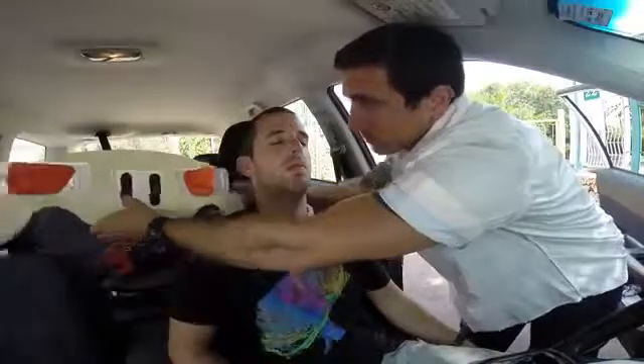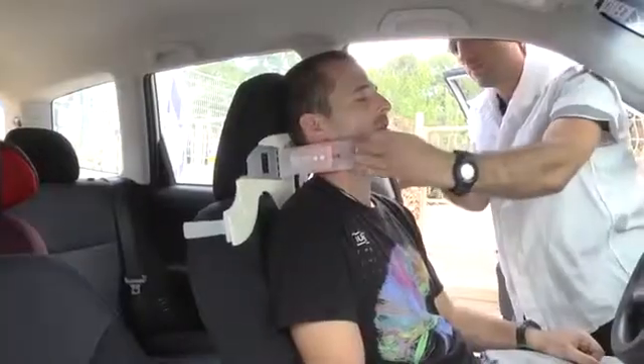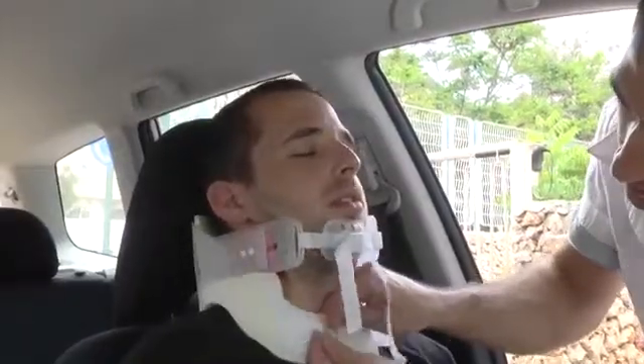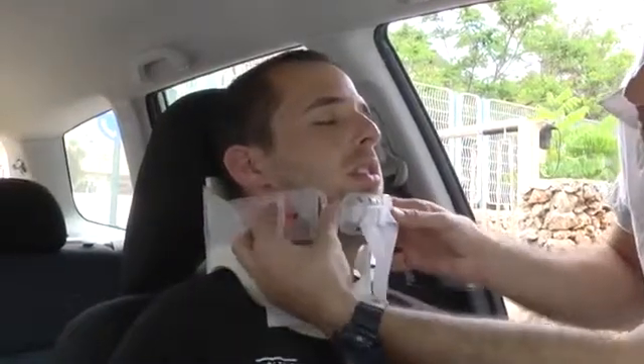The Lubbo can be used in both the supine and the sitting positions. When using the Lubbo Airway Collar on a patient who is sitting upright, make sure to hold both mandible holders while tightening it so the collar does not push itself back. Then use the chest strap and lock the collar in place. Readjust the neck strap and pull the mandibles to the forward position to open the airway. Once the airway is secured, the patient can be transported to the hospital.